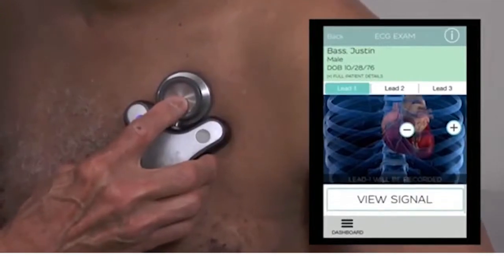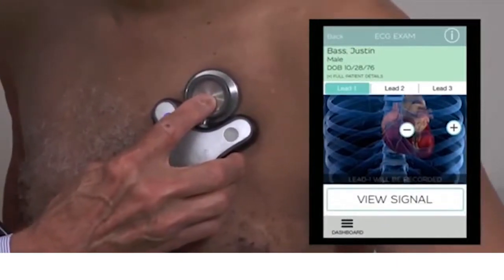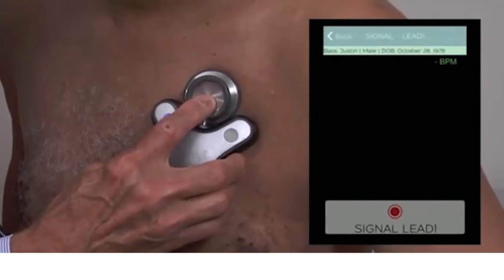Once the device is properly placed in lead 1 orientation and view signal is pressed, a full-screen ECG tracing is displayed.